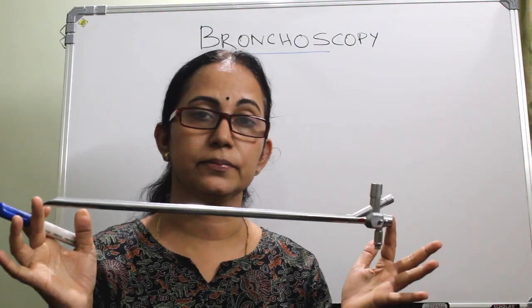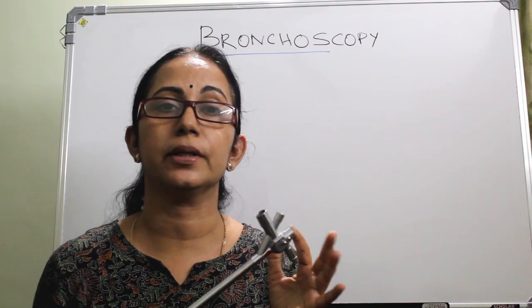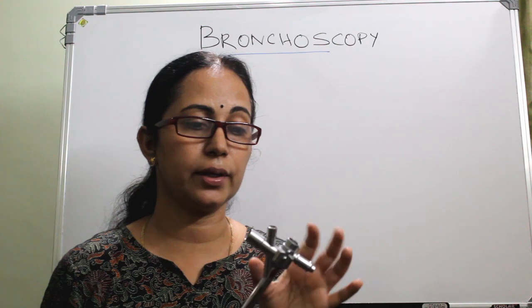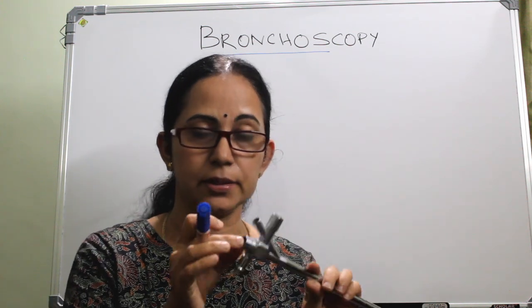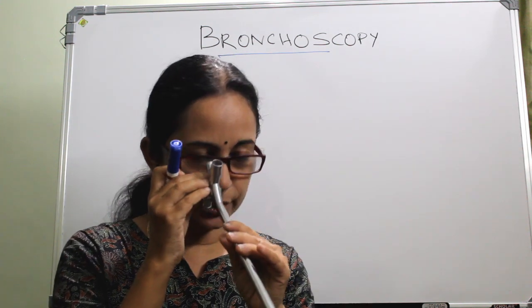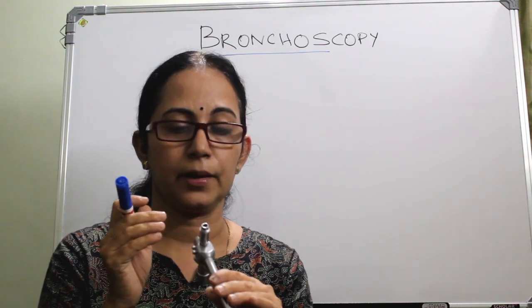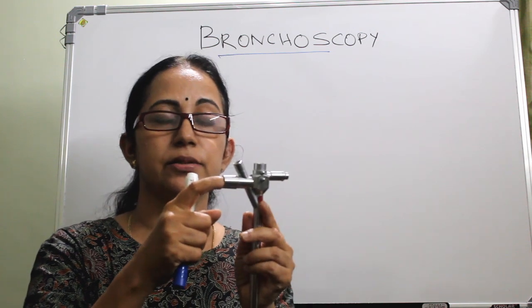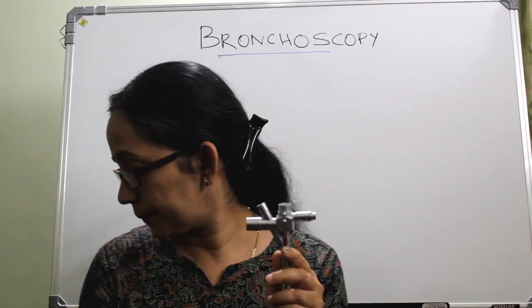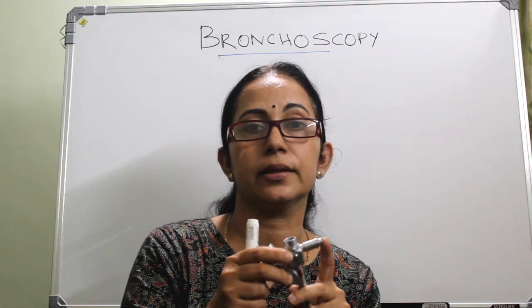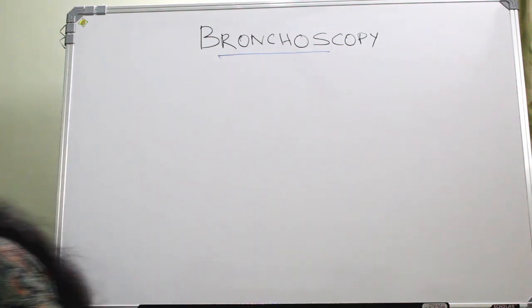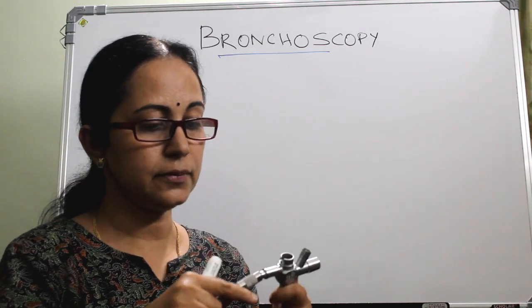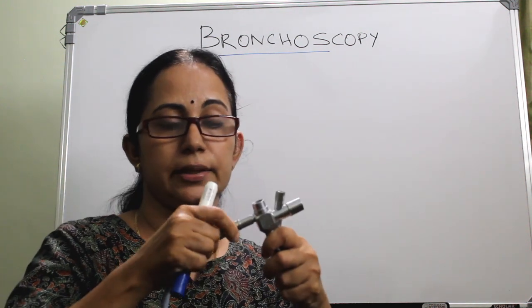This is a rigid bronchoscope and you should be familiar with its parts. It has got an eyepiece to look into, a suction port, a ventilation port, and a connection for the light carrier, which is connected like this.